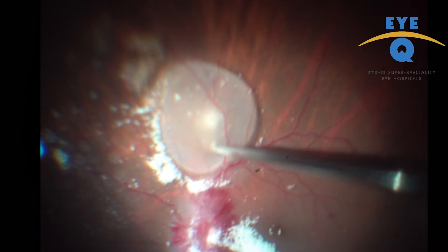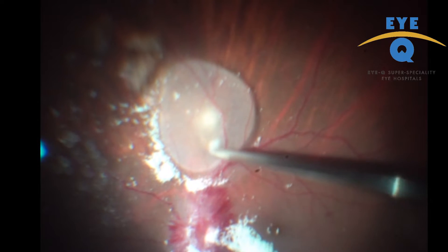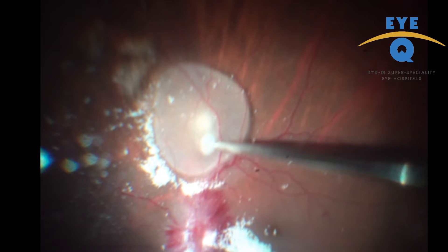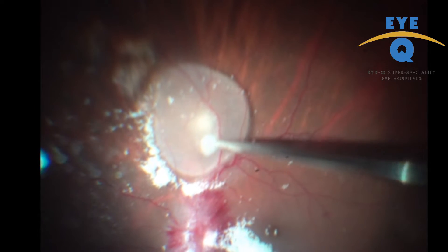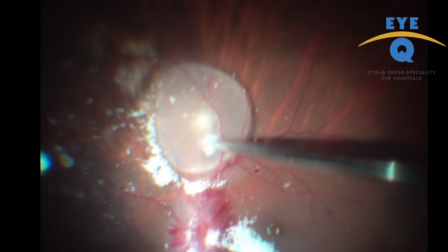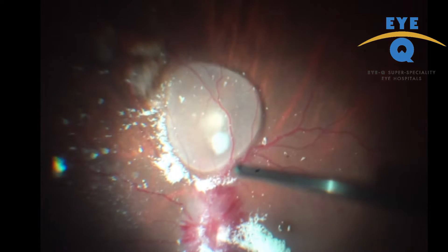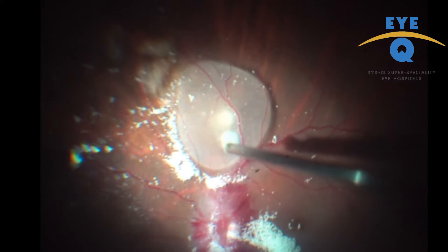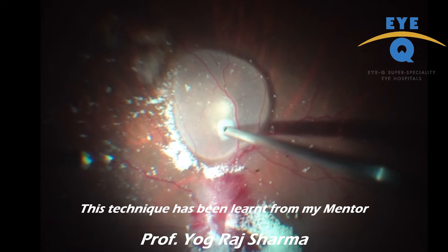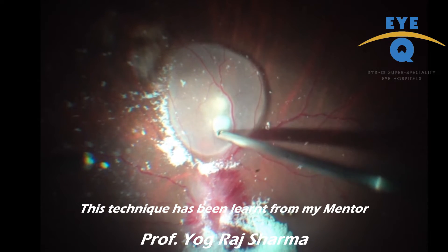Endo-diathermy is done over the cyst at the site of planned retinotomy. Now this is a very important step: the cutter is used to create the retinotomy and to enter the sub-retinal space with the cutter in vacuum mode only.